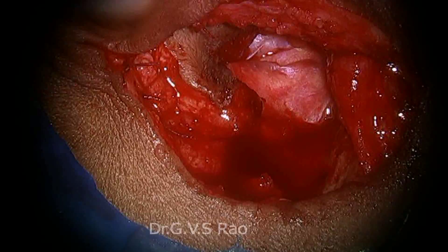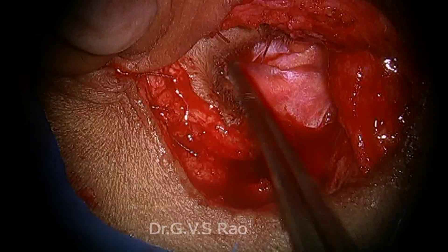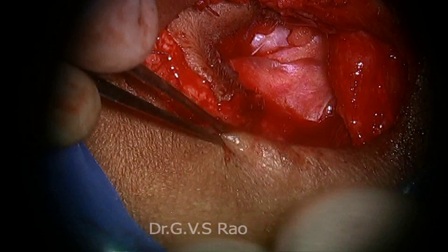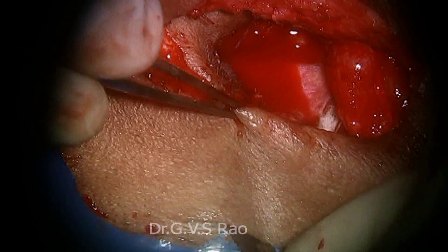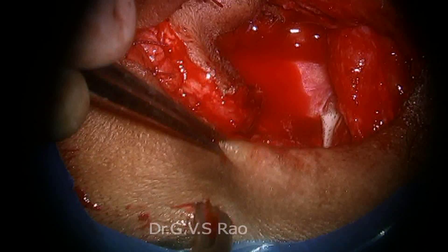This is the skin — I will show through the microscope. See how beautifully the skin is coming and covering here — not only that, the folding of the temporalis fascia covering the facial nerve also here. This is the flap. Now, as a last minute step, I am also applying local. I don't like to keep the drain in the same incision site — I want to keep the drain here. I will give a small incision here with the 15-blade knife. Small incision — take artery forceps and dilate it. Keep the drain from here.